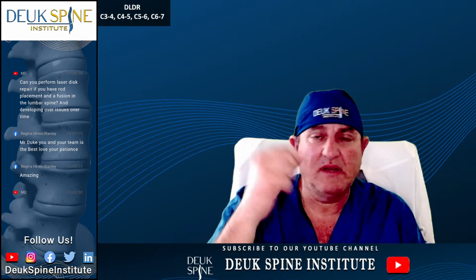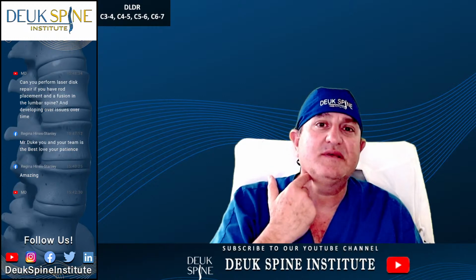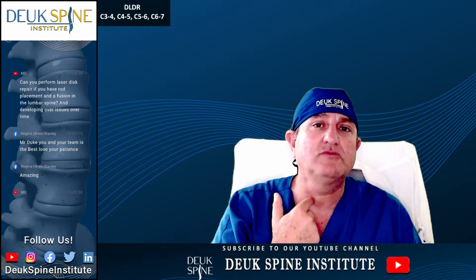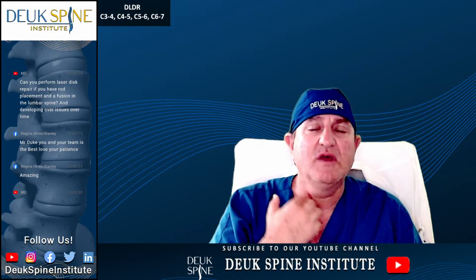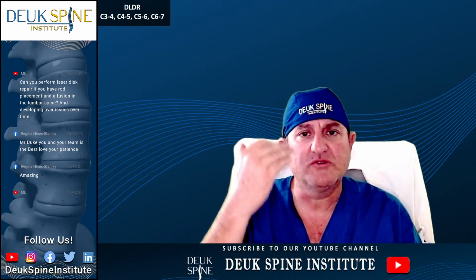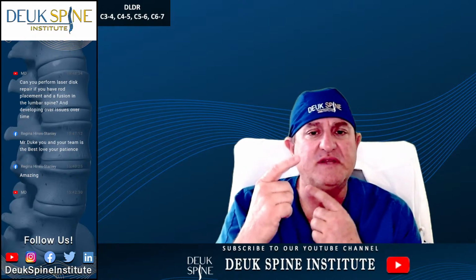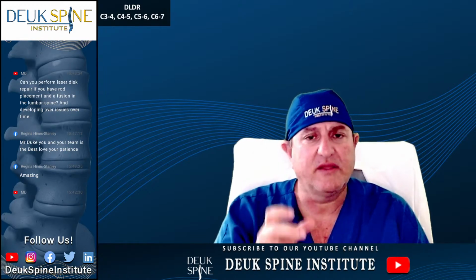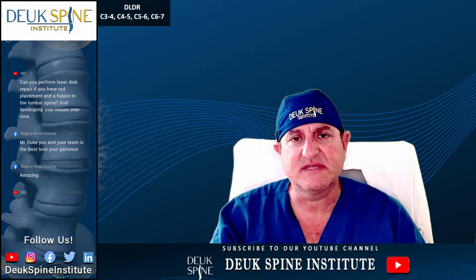So one cut, normally I go up 1 disc and down 1 disc if I'm lucky. I actually went up 1 disc and down 2 discs with that same incision. So yes, he had a lot of soft tissue, and there was kind of a deeper distance from the skin to the spine, so I was able to play with it a little bit better and pull the dilator down and get access to the bottom disc at 6-7.